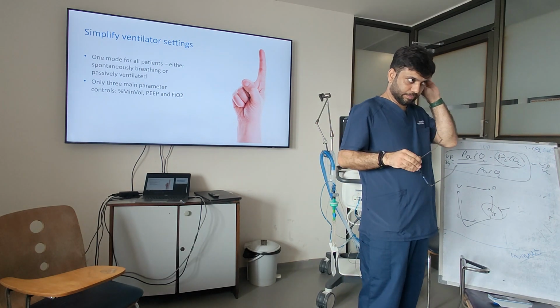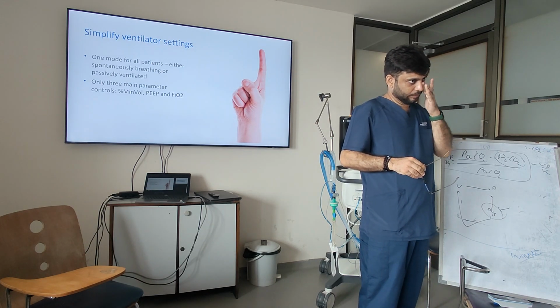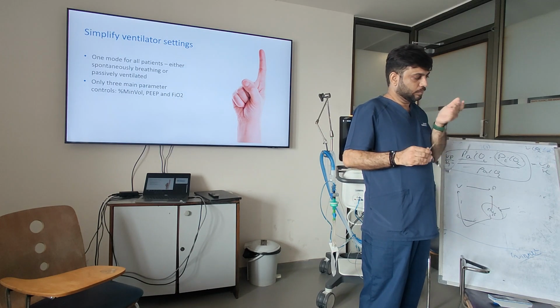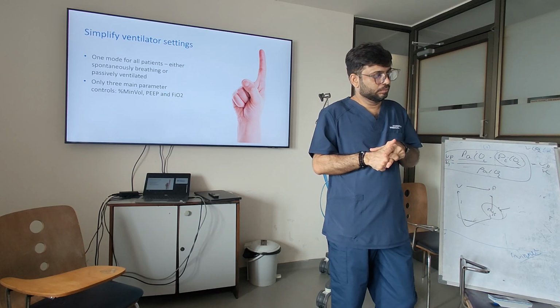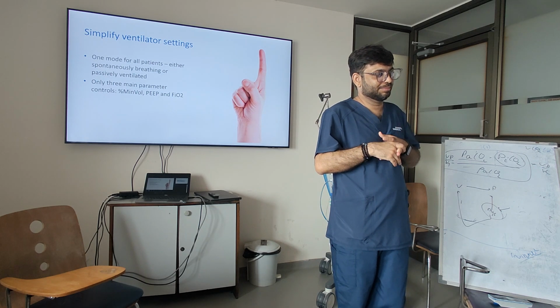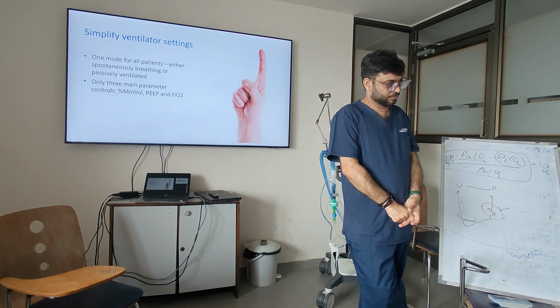After that, it went from active to passive, to readiness to meet criteria, pressure support and spontaneous breathing trial, and told us to remove the ventilator. We didn't touch the ventilator at any time. It went from active to passive and from passive to active.